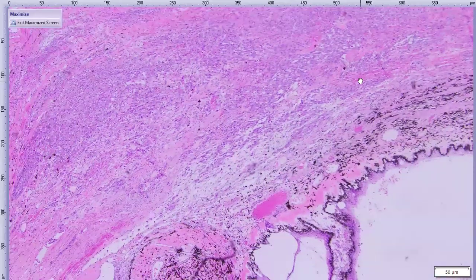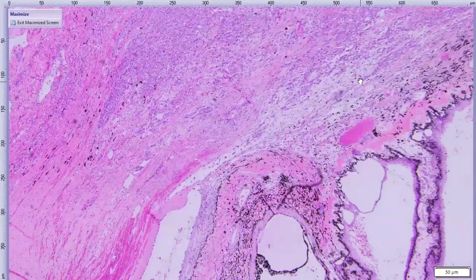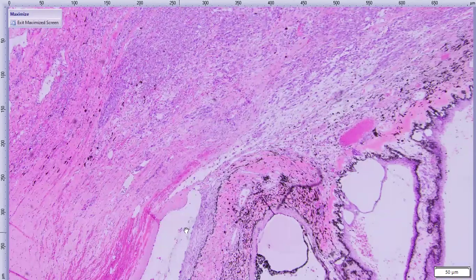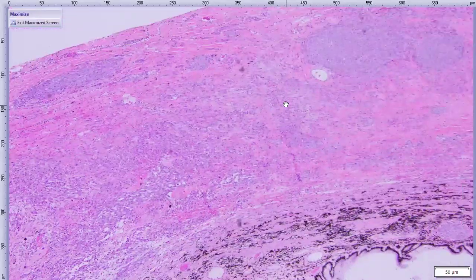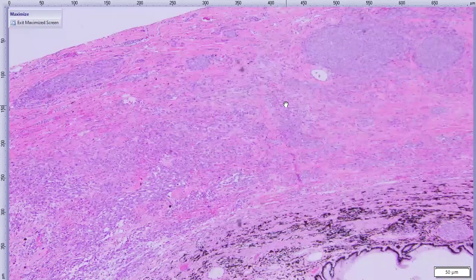And the scleral venous plexus is where eventually the aqueous humor will flow into. So the aqueous humor is in the anterior chamber. It flows out through the trabecular meshwork, which is right in this area. It's sort of, once again, obscured by neoplastic cells. And then it exits the eye via the angular aqueous plexus that then joins up with the scleral venous plexus.